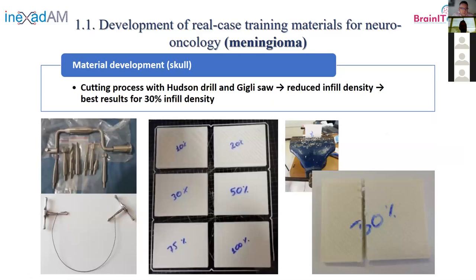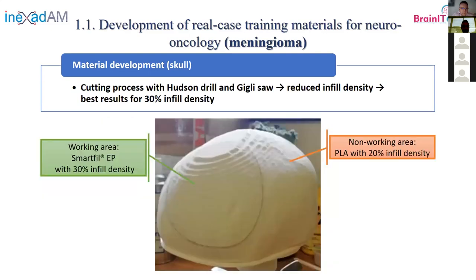Students are going to use hand tools like a drill, so we tested different infill densities to see which was most appropriate for the cutting process. Finally, we chose 30% infill density with the Smart EP filament for the working area. The non-working area of the skull used standard PLA with 20% infill density.